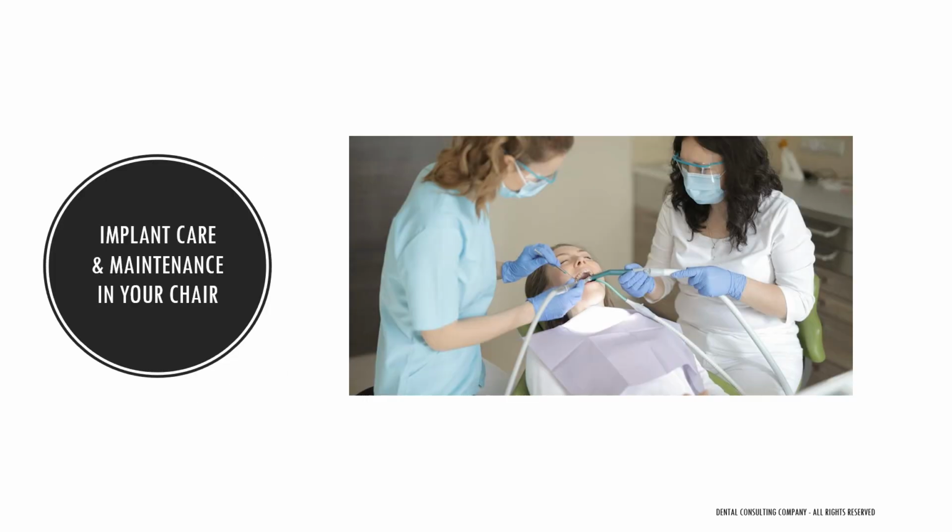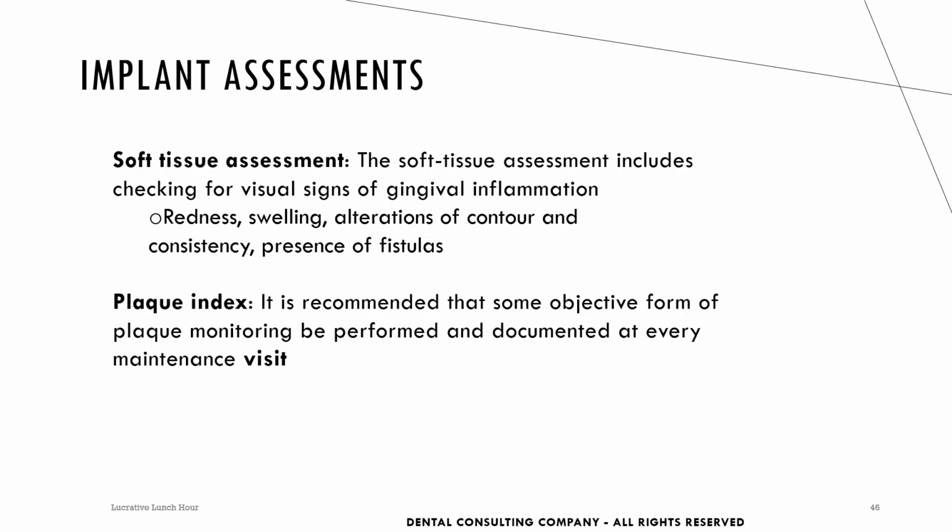Our next topic is going to be implant care and maintenance and what's needed. These are some examples of assessments that need to be completed at recare visits for patients with implants. Identifying these assessments will determine if the patient is implant health, implant perimucositis, or peri-implantitis.